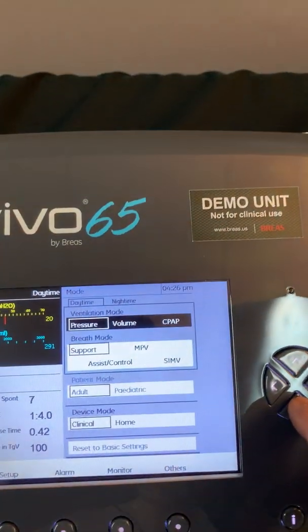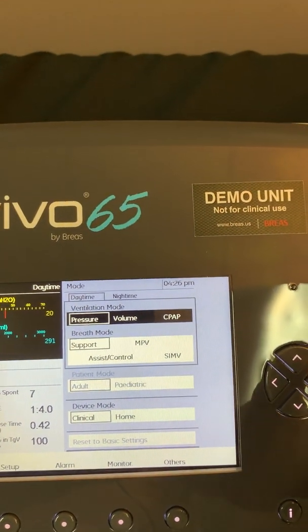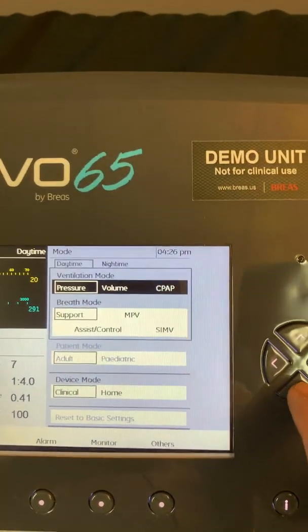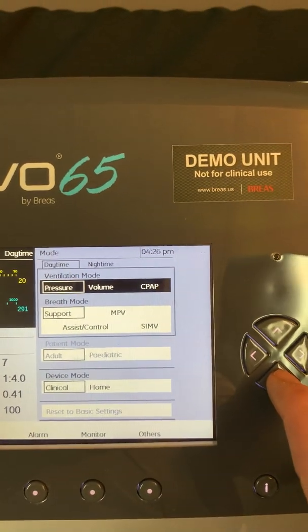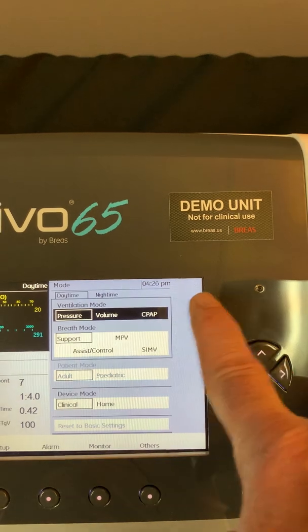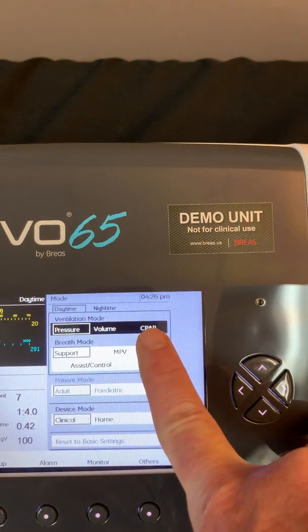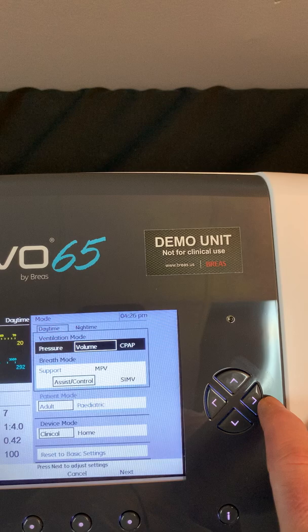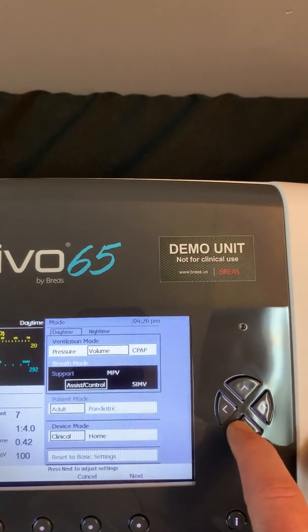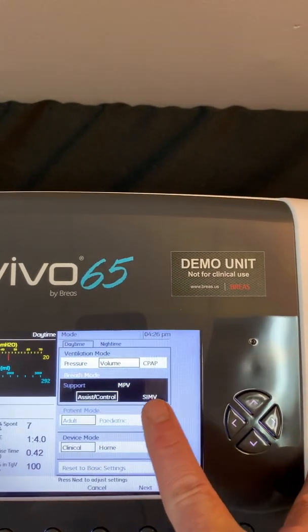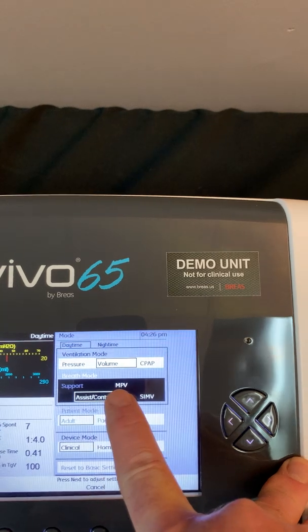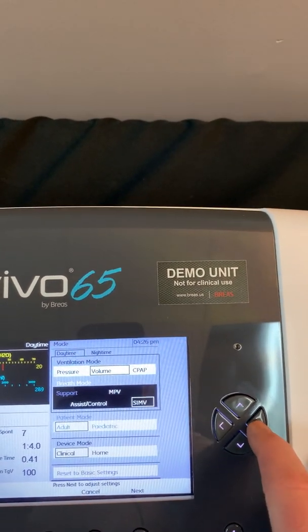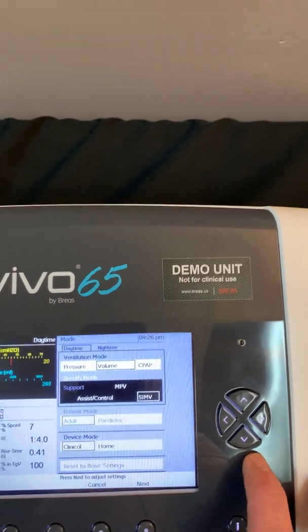I'm going to place the device into a volume mode just to give you a demonstration on how to make a mode change. I've highlighted the ventilation mode parameter, I'm going to move the box over to volume, and then moving down my choices are either volume assist control, volume mouthpiece ventilation, or volume SIMV. Let's go ahead and choose volume SIMV.